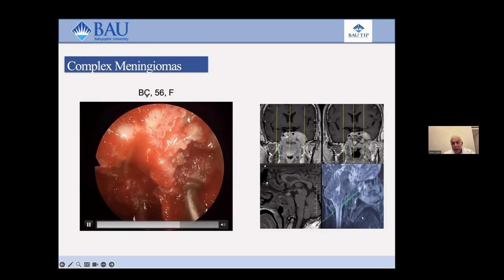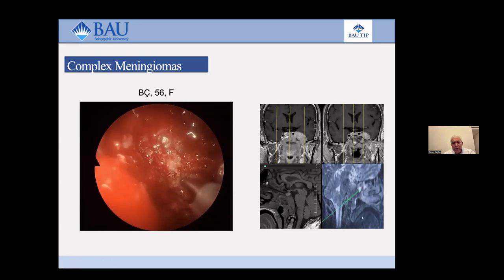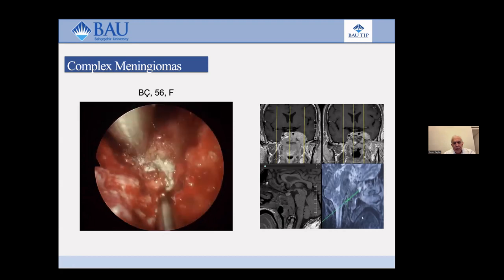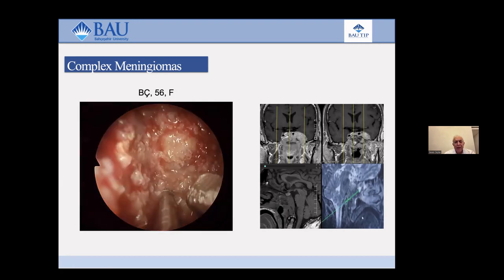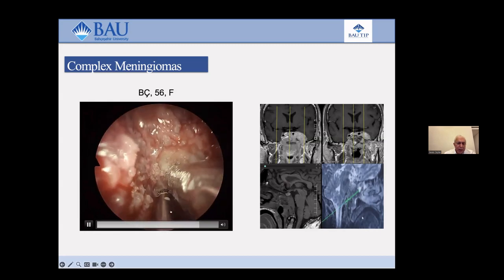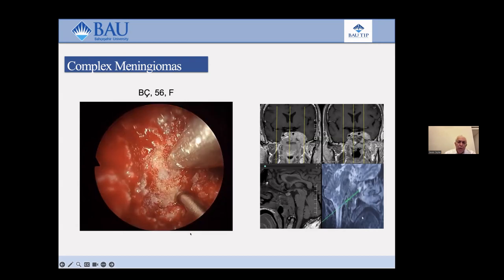At this stage, we routinely used Doppler, and the tumor was removed from between the horizontal paraclival and petrosal segments of the carotid arteries, and at the last stage we reach the craniocervical junction, and the extending tumors were removed.